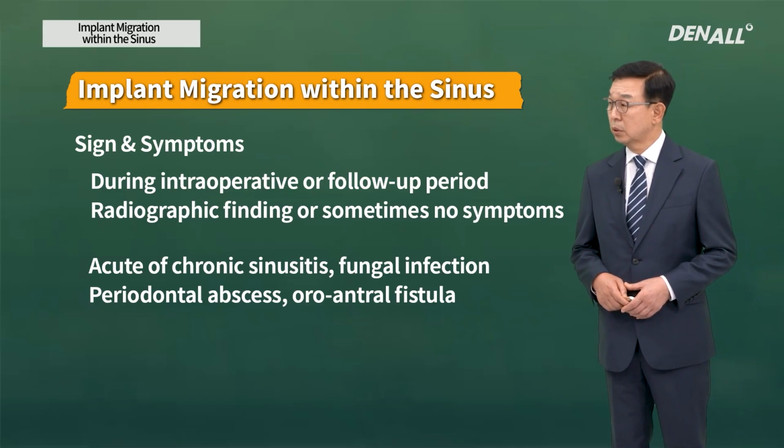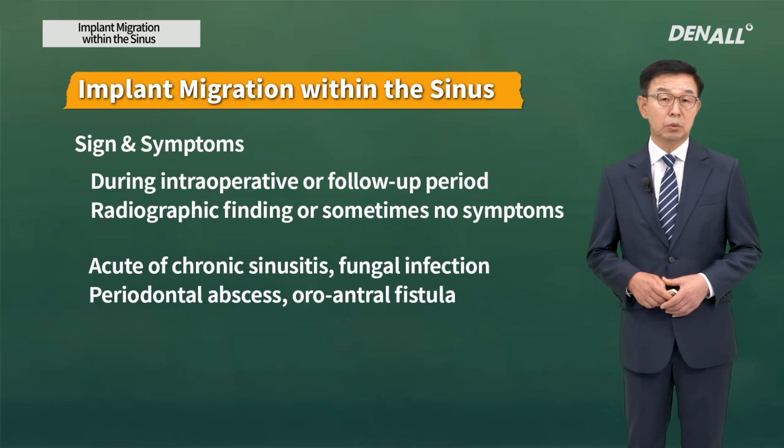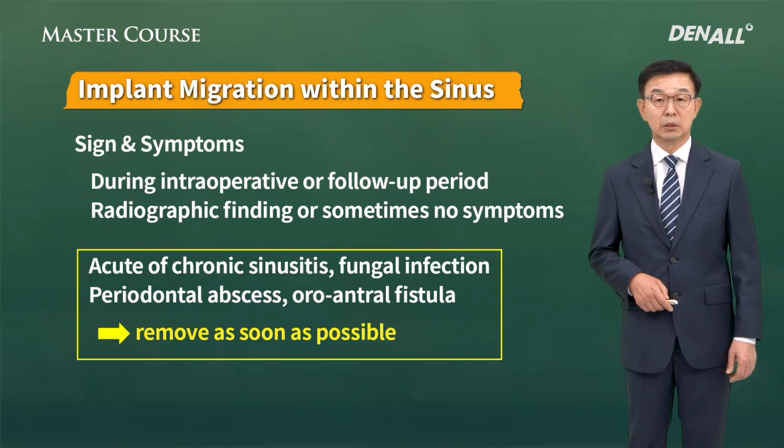Therefore, when you do crestal approach or window approach, you need to do regular checkups, and if the implant has migrated into the sinus, you need to remove it as soon as possible.